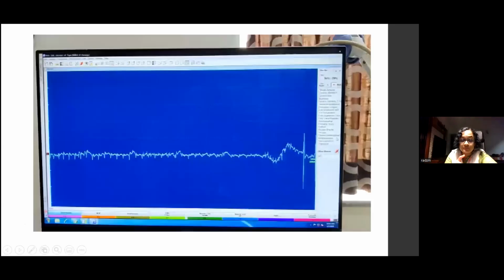So one more thing I didn't say. When you first put a needle in, you're going to be looking at 10 millisecond division. So each division lasts 10 milliseconds, and you're looking at maybe 200 microvolt sensitivity. So you will not see it as a typical myotonic discharge. You just hear weird sounds, and you think, okay, there's something going on here.